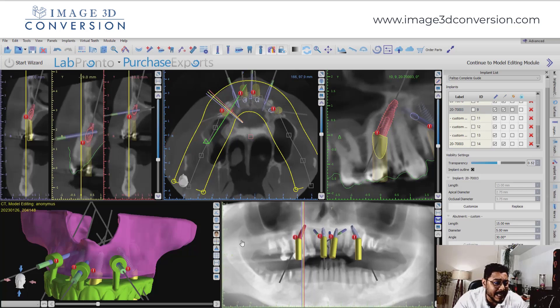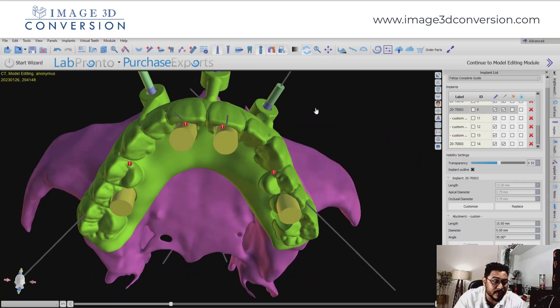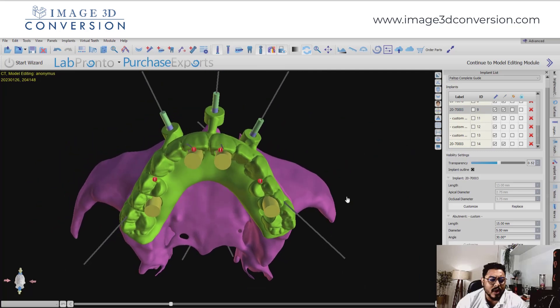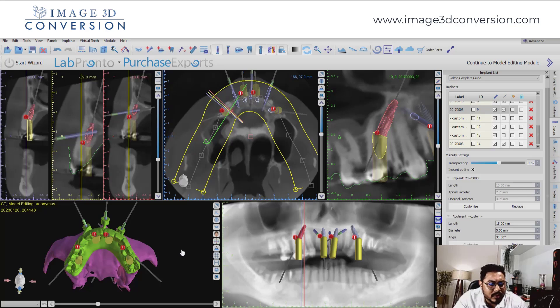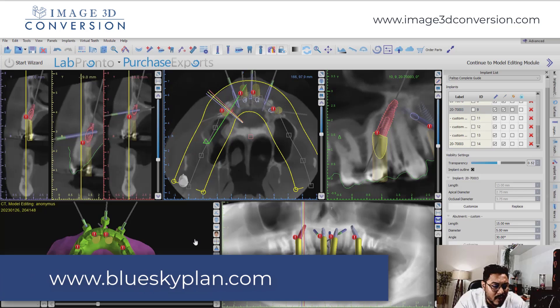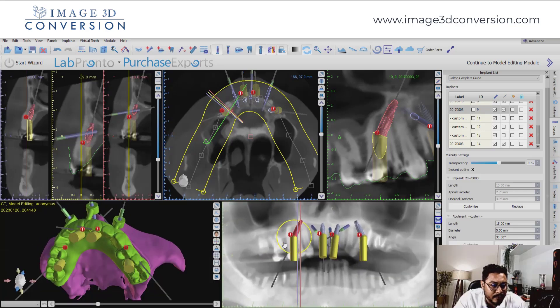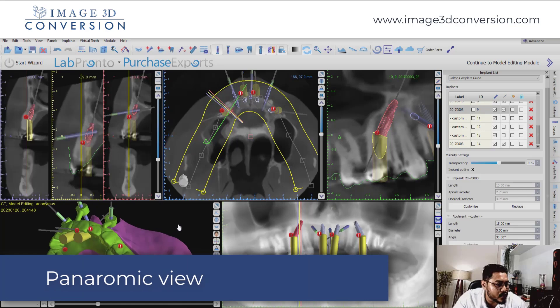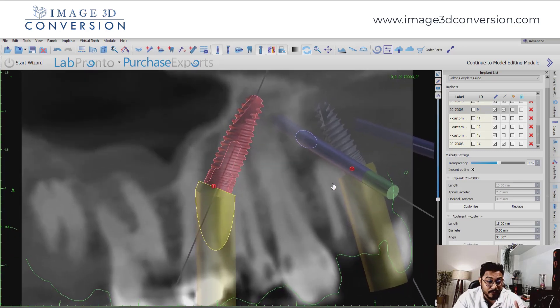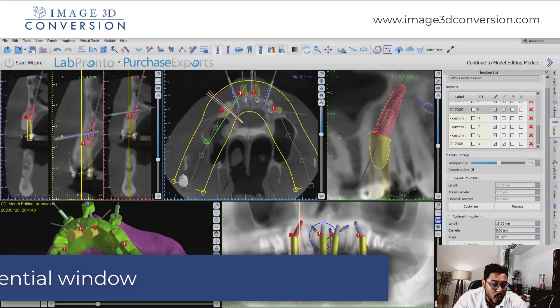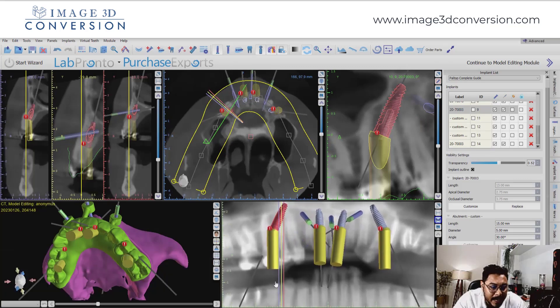We have five windows in Blue Sky Plan software to explore and review the treatment plan very confidently — to ascertain if you are on the right track in treatment planning and to avoid any challenges. If you haven't installed Blue Sky Bio's Blue Sky Plan software, simply visit their website and download it free of cost. We have five windows: pan view (panoramic view), true view, sagittal window, 3D view, and tangential window.